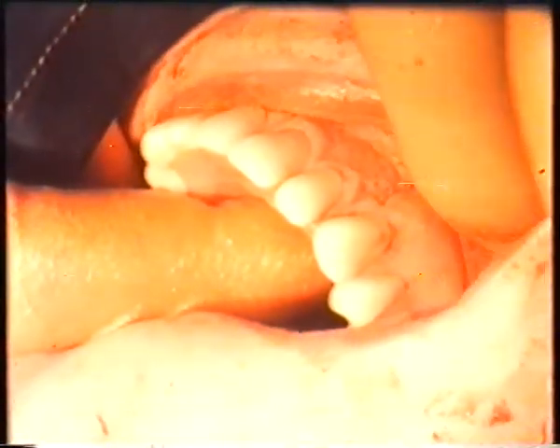With the completion of suturing, bleeding is controlled and the upper denture can be fitted. Similar surgical procedures are carried out in the lower jaw, and the lower denture is fitted.